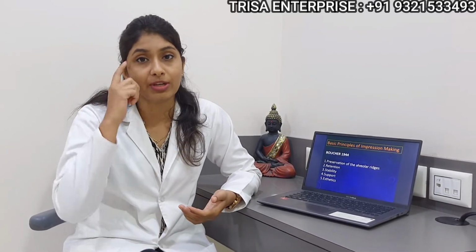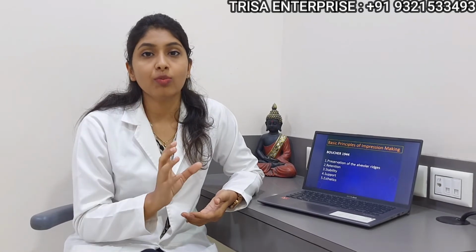Now, impression, we say that we make the impression rather than take it. That is because, as Devan said, the impression actually should meet the mind of the dentist even before it meets the hand. As in, you make the impression in your mind first. As soon as you view the patient's ridges, you should know how your impression is going to come out to be. This can happen only when you have an in-depth understanding of the procedure that you're going to perform on your patient. Now, I'll be starting with basics of impression making so that you understand the tissues a little bit even before you understand the procedure.